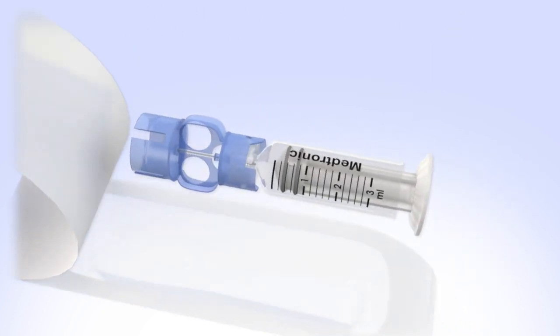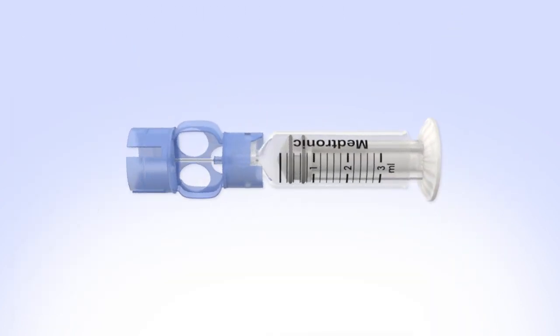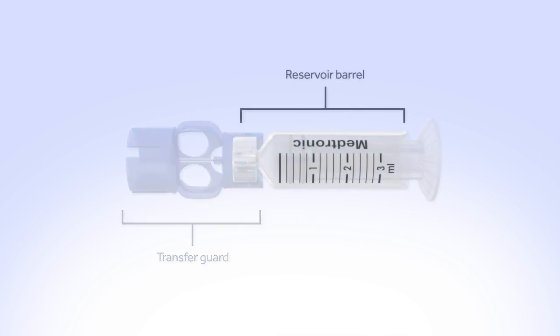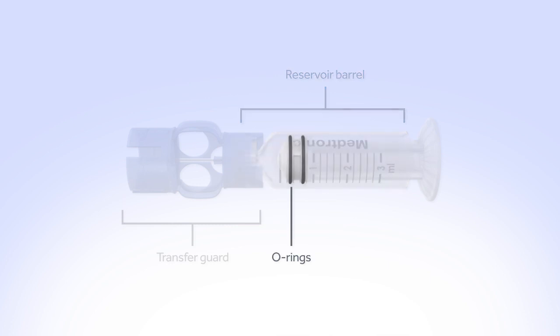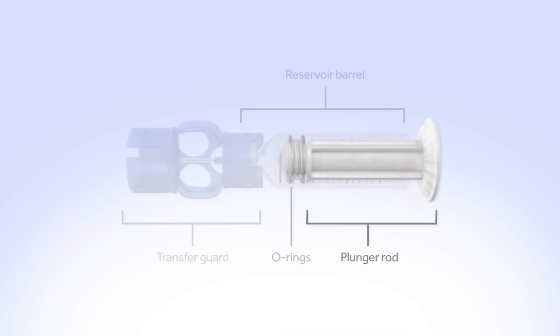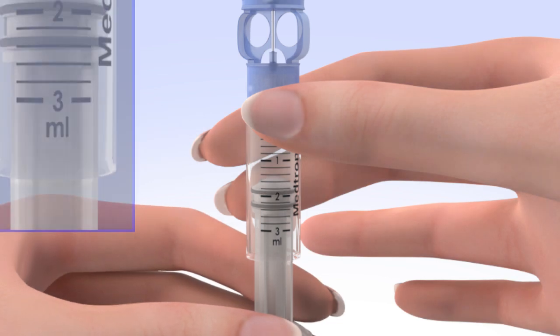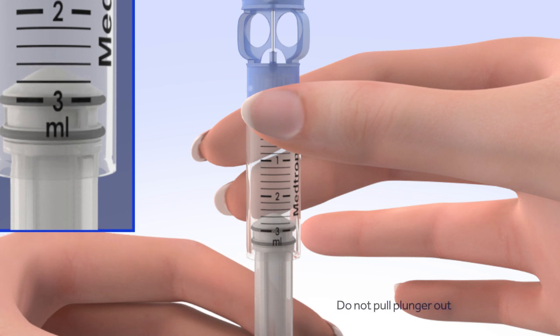Let's stop for a minute and look at the different parts of the reservoir. The transfer guard attaches the reservoir to the insulin vial so it can be filled with insulin. The reservoir barrel holds your two to three day supply of insulin. The o-rings prevent insulin from leaking out of the reservoir. The plunger rod is used to fill the reservoir with insulin. Pull the plunger so the top of the o-ring is positioned at the amount of insulin you plan to put in the reservoir.